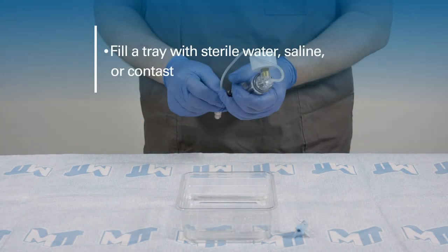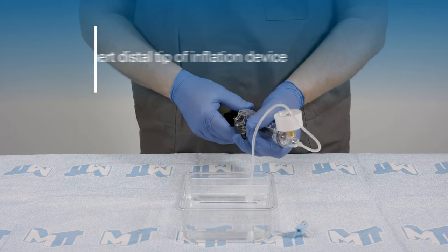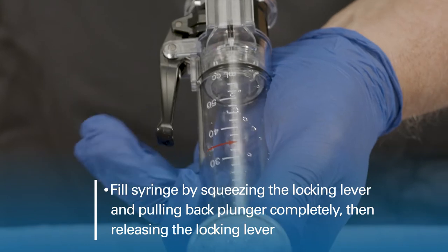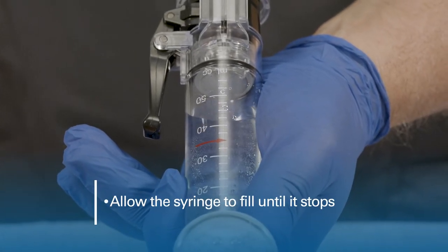Fill a tray with sterile water, saline, or contrast. Insert the distal tip of the inflation device. Fill the syringe by squeezing the locking lever and pulling back the plunger completely, then releasing the locking lever. Allow the syringe to fill until it stops.